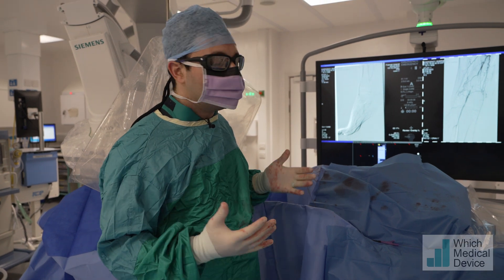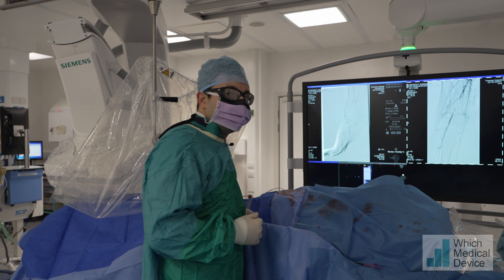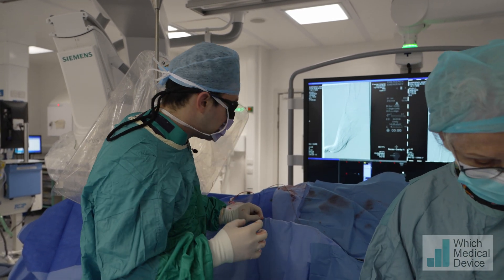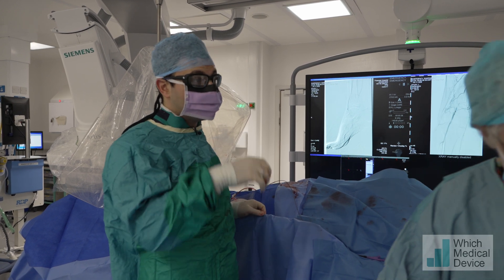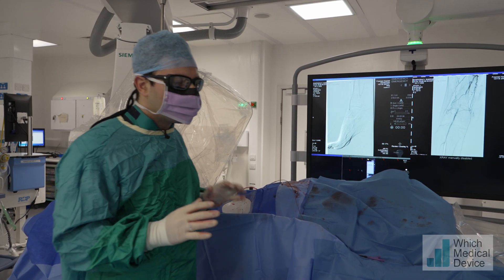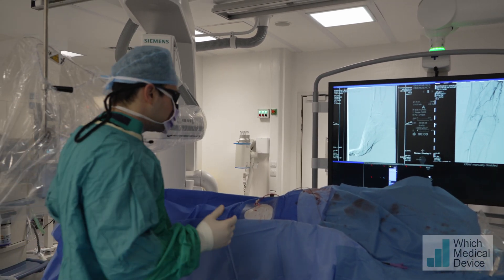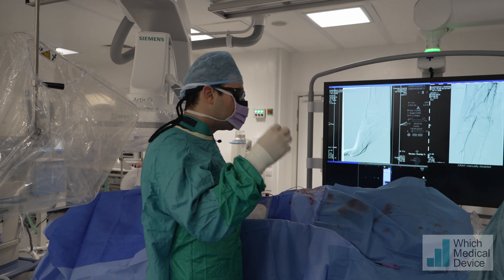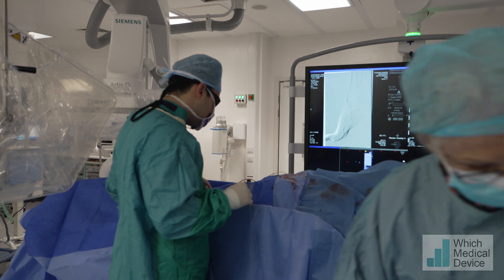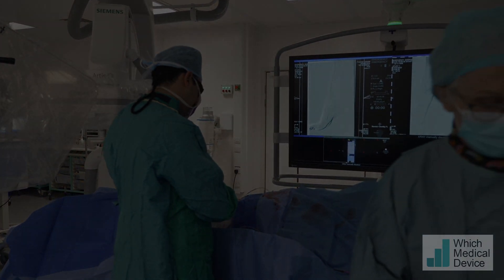Now we'll try and close the vessel and close the hole that we made. What are you going to use for a closure device? In this case we're using the Star Close, which deploys a little clip outside the vessel. There was a little bit of calcium on the vessel wall and I don't want to use any devices that leave a clip inside in case it catches, so we use a device that deploys the clip outside. We'll flush the sheath and finish up.